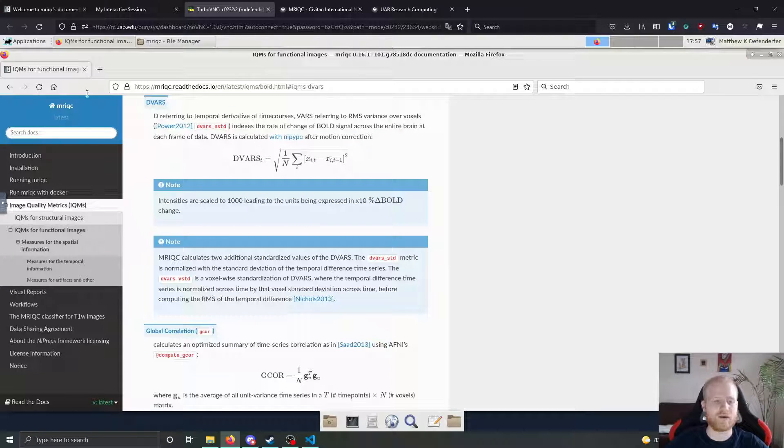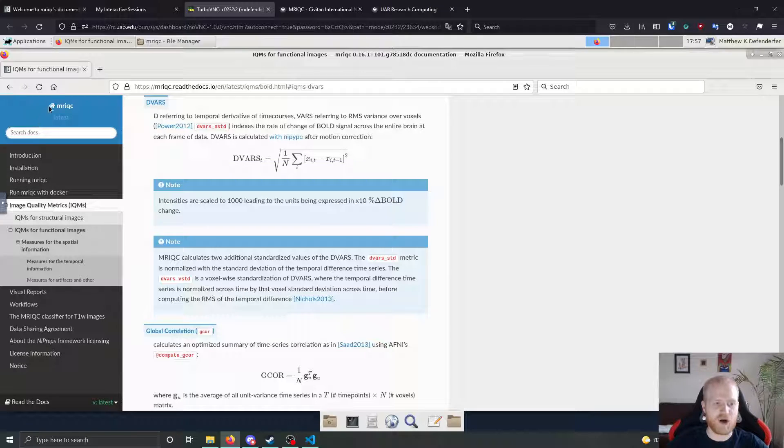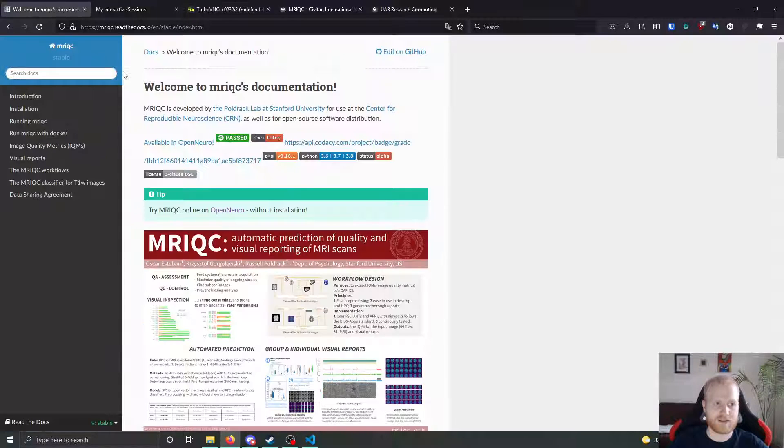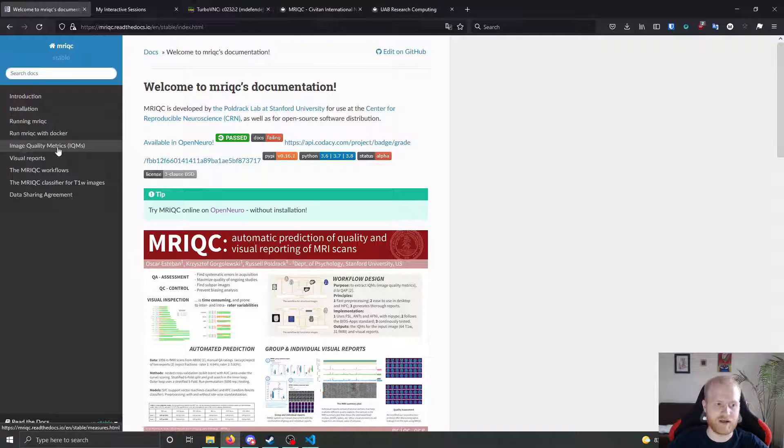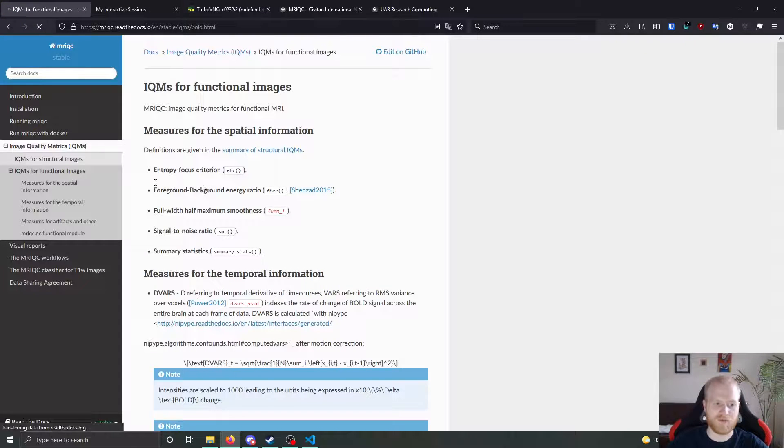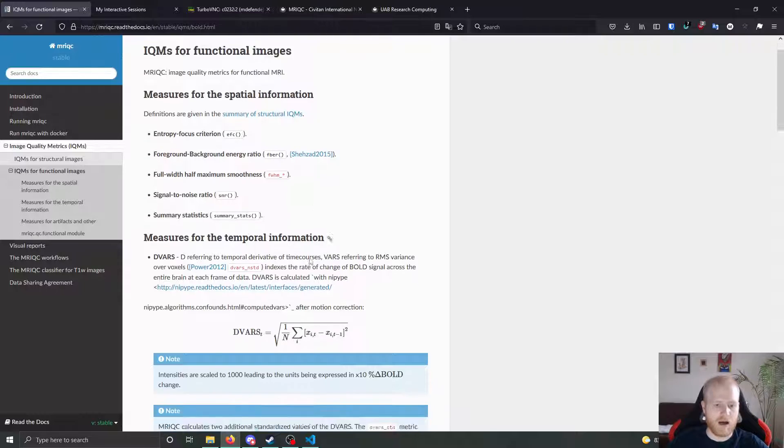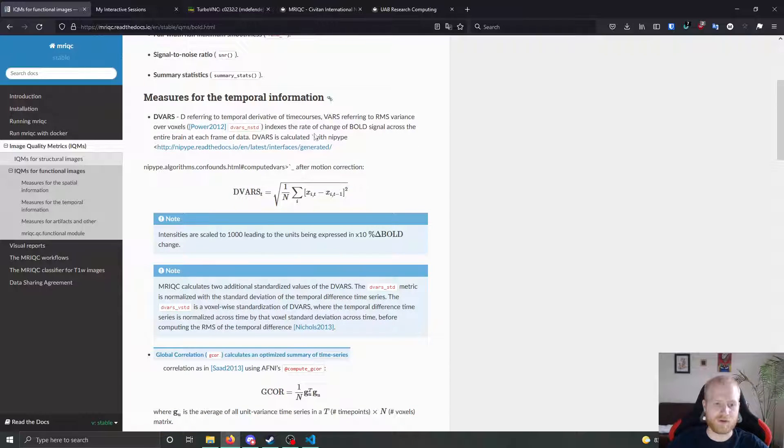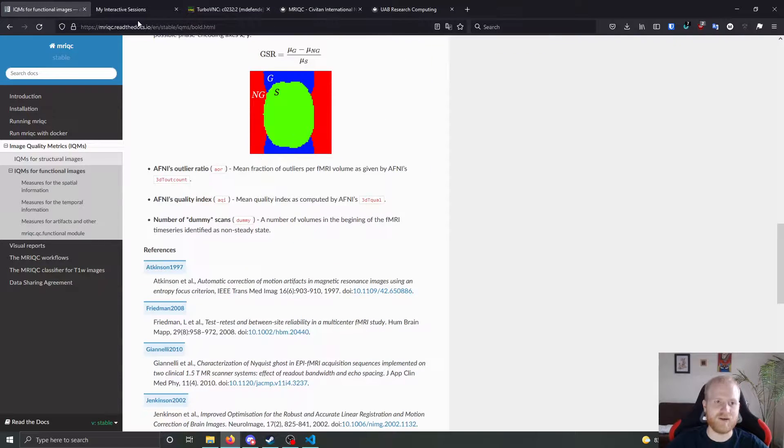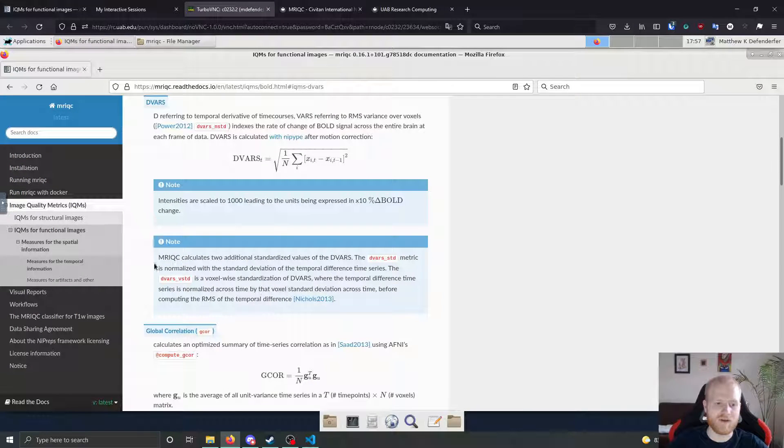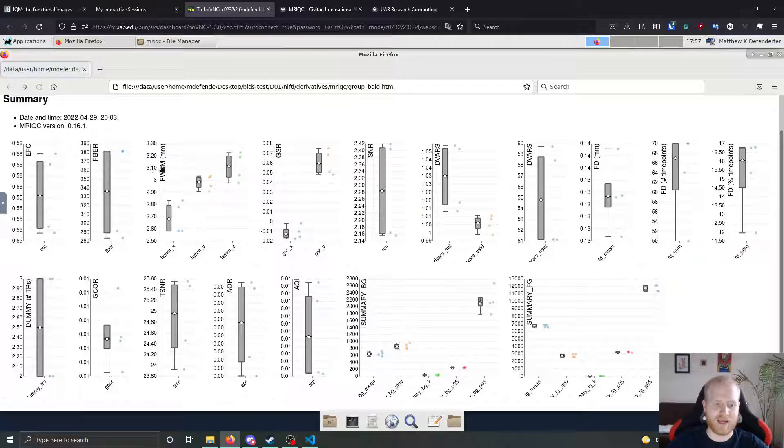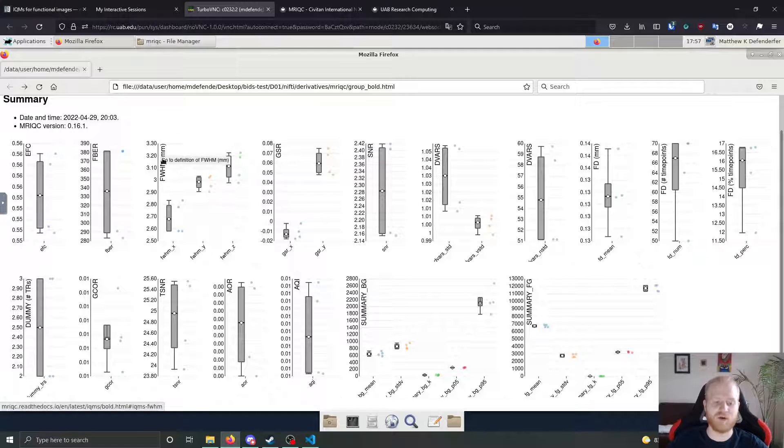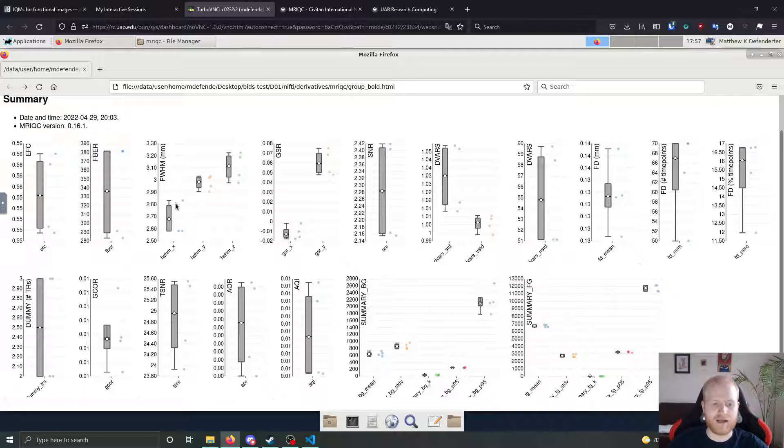So I would read through these and these are all on the MRI QC docs. So if you went back to the docs here and clicked on image quality metrics, you can do it for both functional image and structural images. You can read through all the metrics here as well, but if you just need a quick reference to what one of them is, then you can click on the name in the group output file as well.